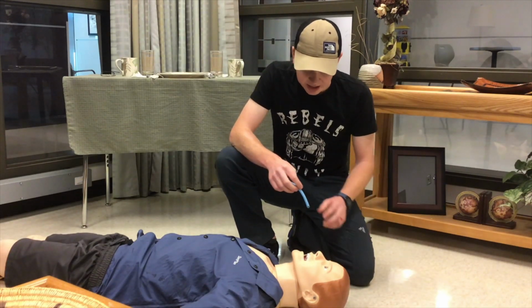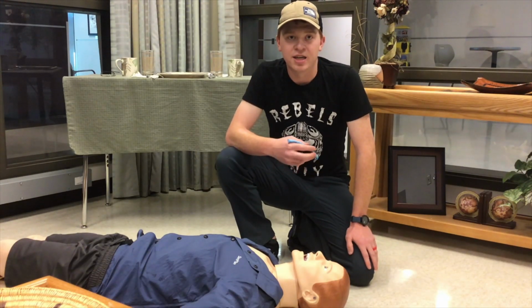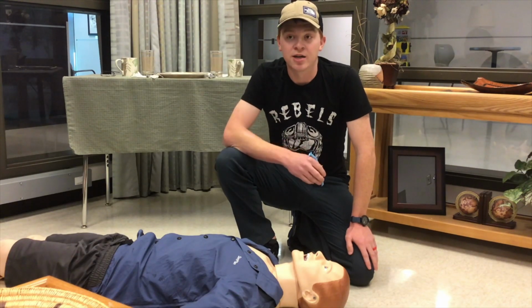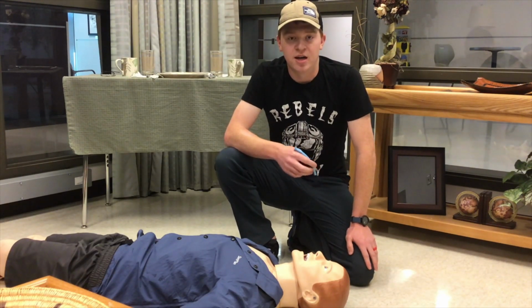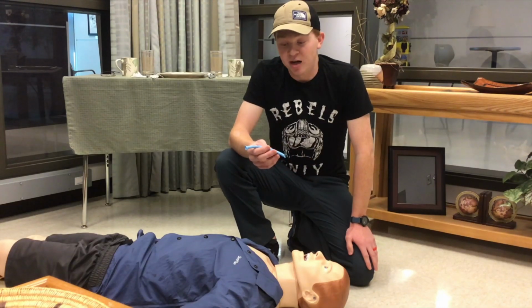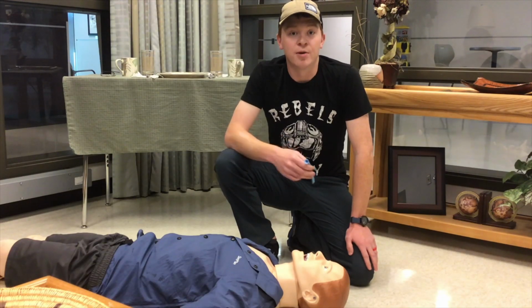So then we're going to go ahead and select a nostril. A couple things you want to be looking for is any kind of deviated septum, one nostril being larger than the other, and you would want to pick the larger nostril. You are able to put one in both nostrils if needed, and you can also use this alongside an OPA.